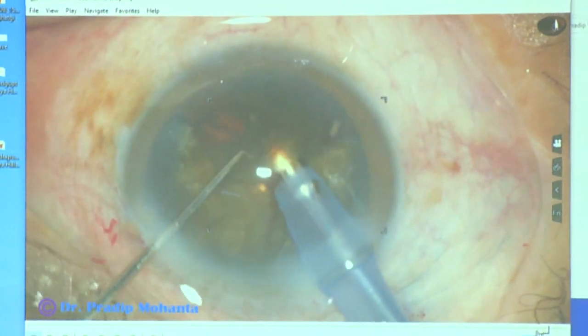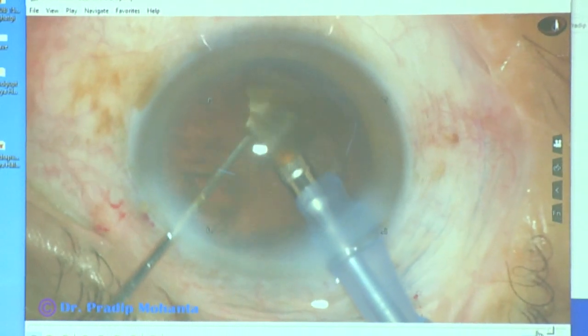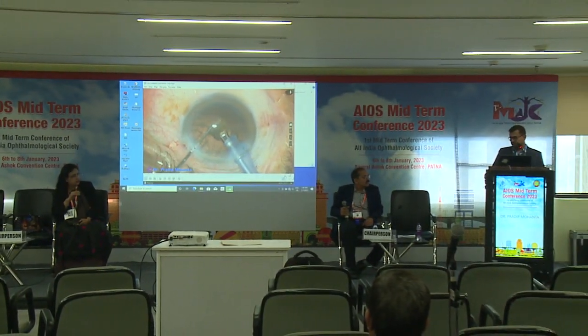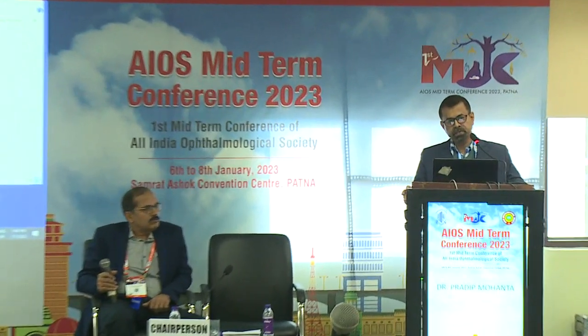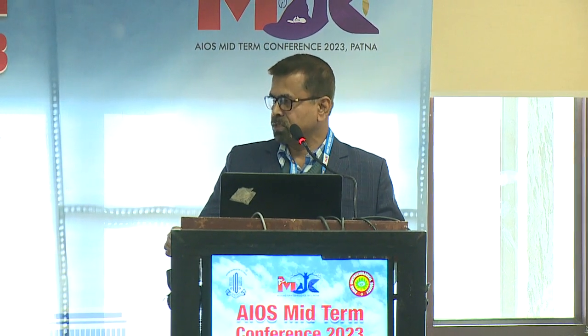Very nice surgery, excellent demonstration of how to deal with hard cataracts. Do you use any special viscoelastic to protect the endothelium? Yes, I would say to the beginners to use modified soft shell technique like chondroitin sulfate first, and beneath the chondroitin sulfate you use HPMC, but I manage with HPMC in most of the cases.